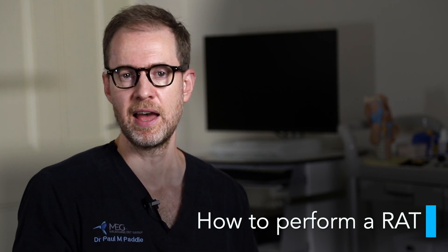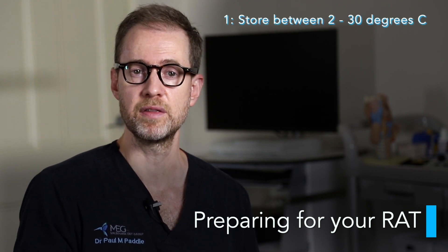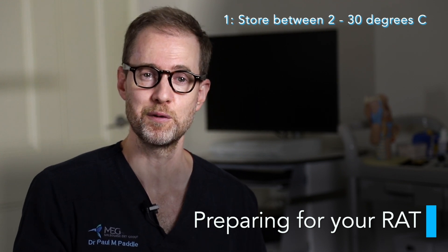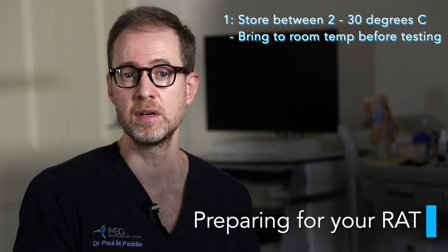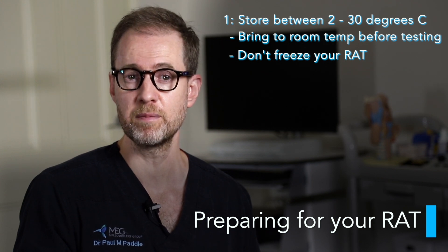Different tests will vary, but the general lessons in this video will still apply. We will start with what most people are interested in: how to perform a RAT. There are some things you need to do before the test. If you are storing the test or even leaving it in the car, make sure you keep it between 2 and 30 degrees Celsius at all times to ensure it doesn't go off. A useful idea is to simply keep it in the fridge since most fridges are around 4 degrees, and remove it prior to testing. However, make sure you allow it to come to room temperature before testing. Also, don't freeze your RATs. Tests can be stored in that temperature range for 12 months from the date of manufacture.